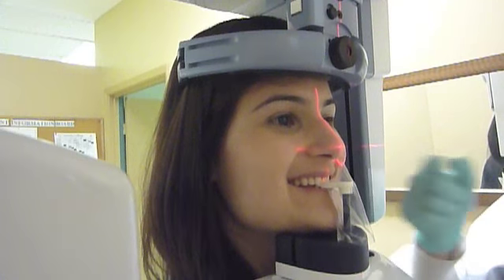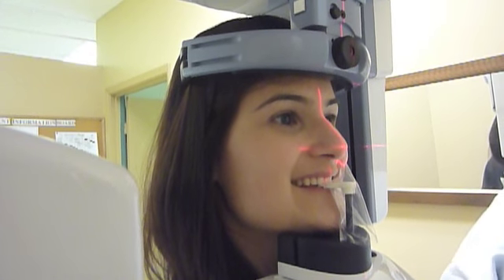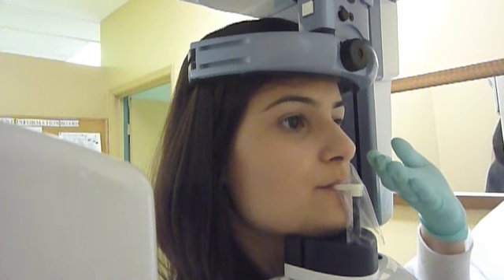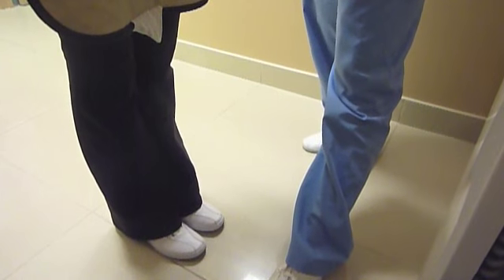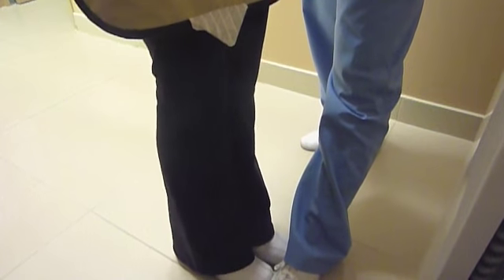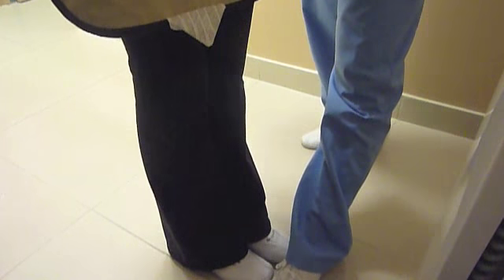Instruct the client to close their lips, swallow, and raise their tongue to the roof of their mouth until the exposure is complete. Have the client wiggle their feet up to the designated line. You can use your own foot as a guide. Instruct the client to stay still for the entire exposure.